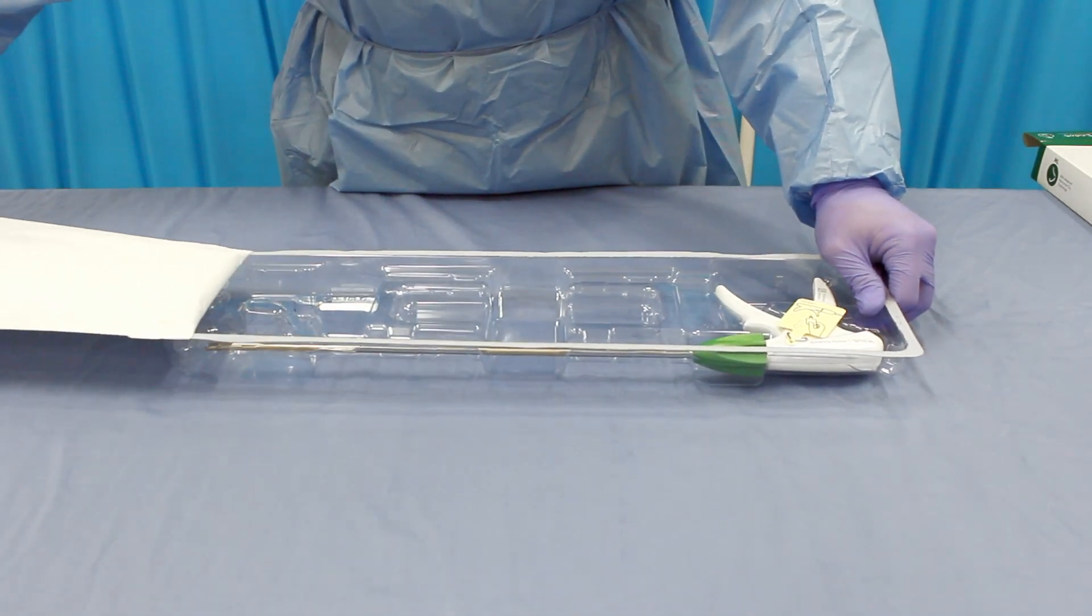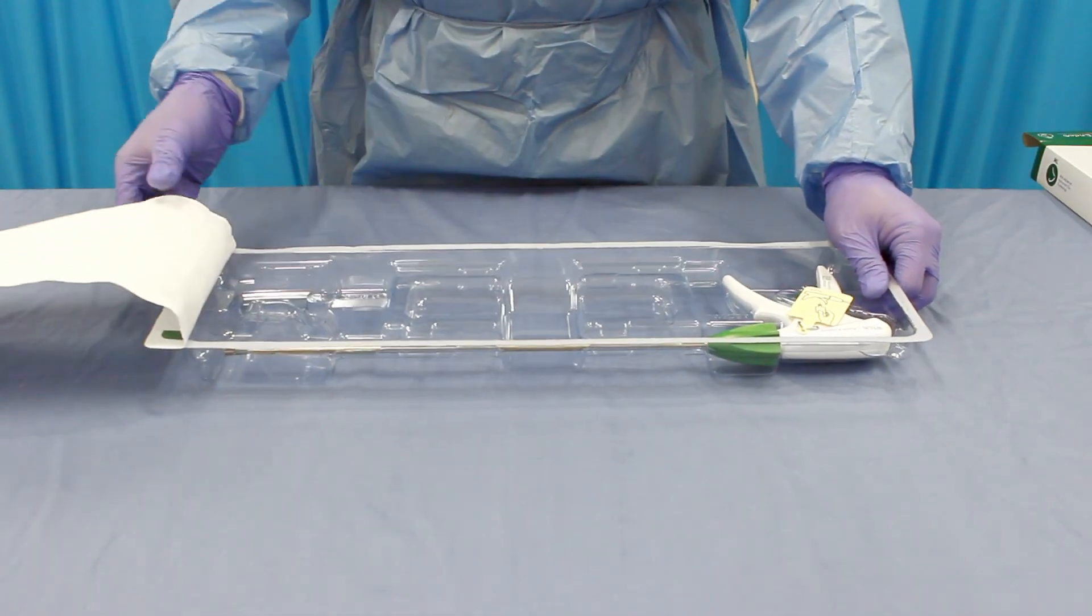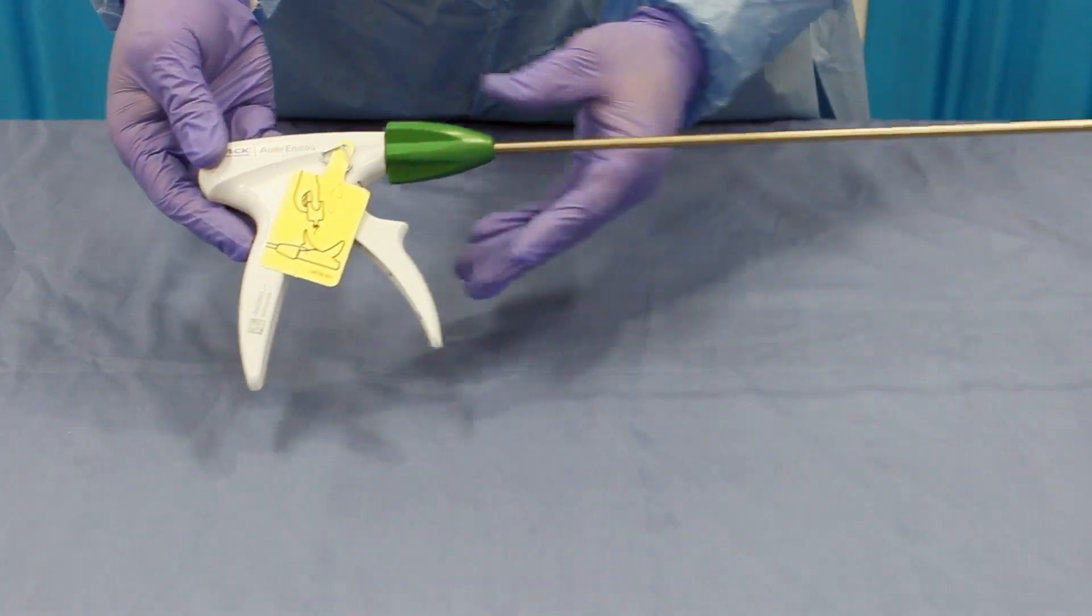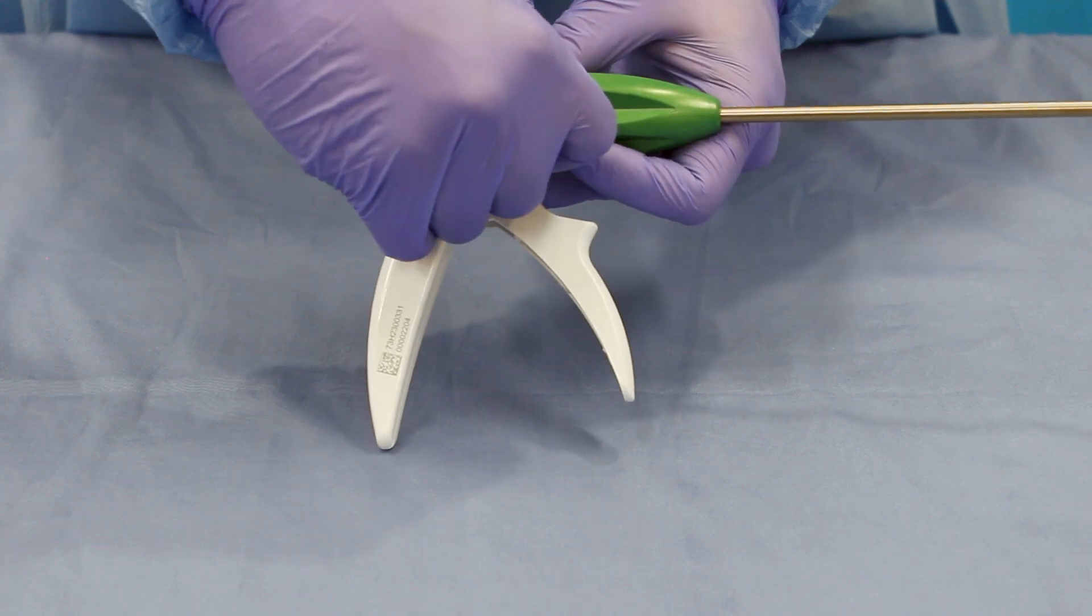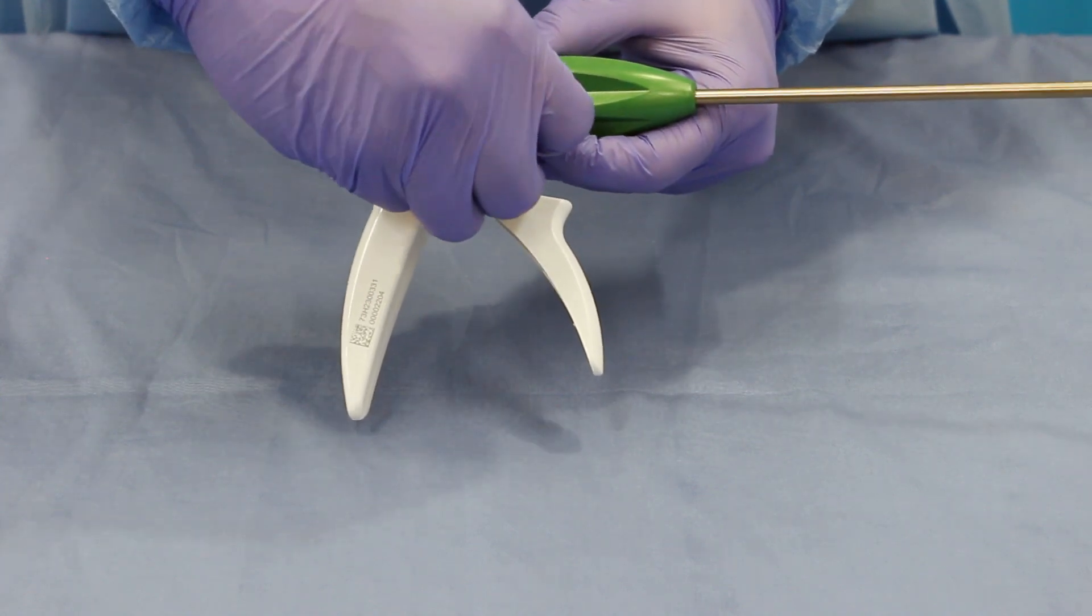To use the Weck Auto Endo 5 Automatic Hemolock Clip Applier, follow these steps. Step 1: Prior to use, remove and discard lock pin card attached to the applier. To remove the card, pull up on the card.